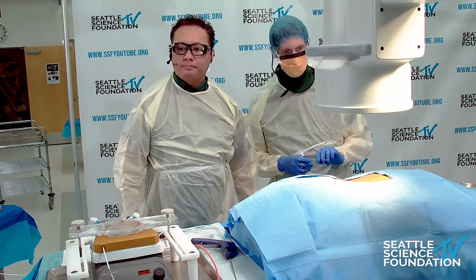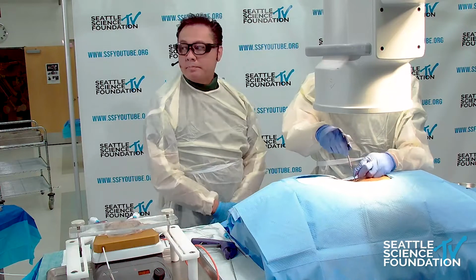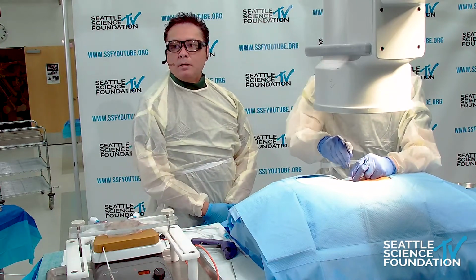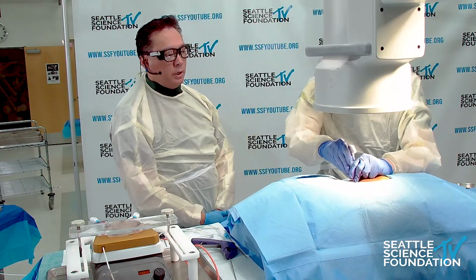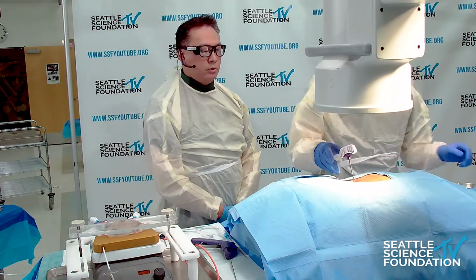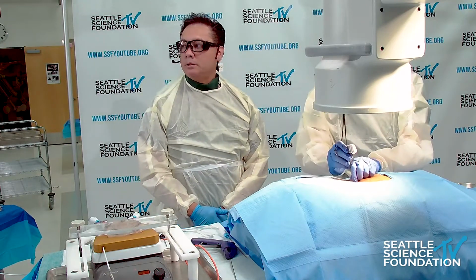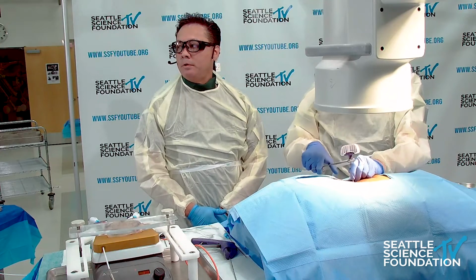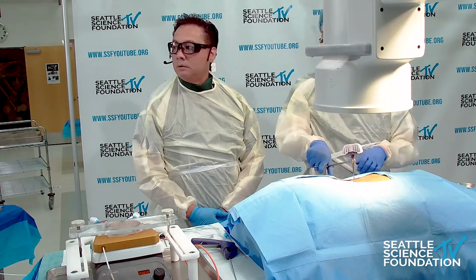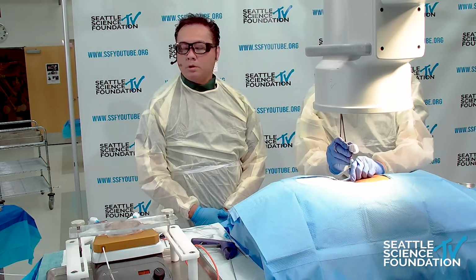Great. So we have Dr. Fravert going to access the pedicle here. Right now, we're going to look at accessing the AP view, the standard approach to doing a bipedicular approach. As you can see, if we can pan in on the AP view for the imaging there, we start pretty much at the 2 o'clock position.